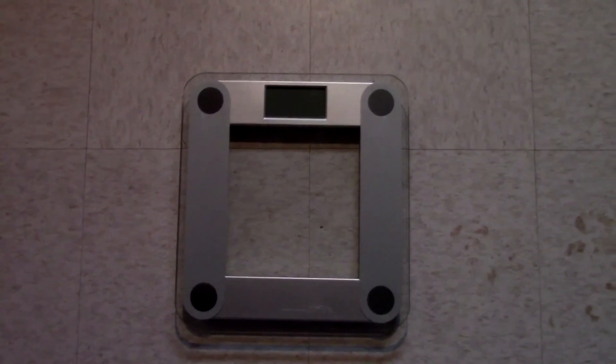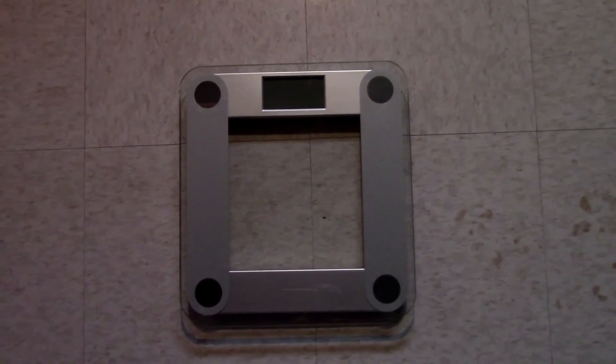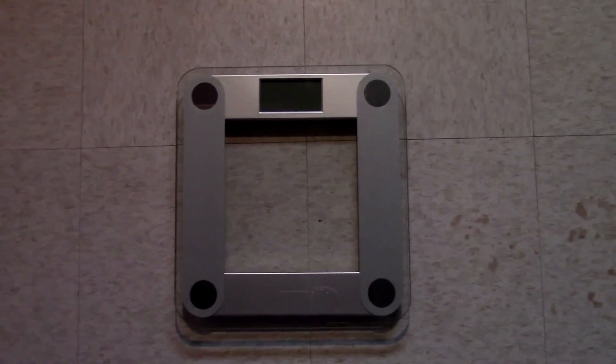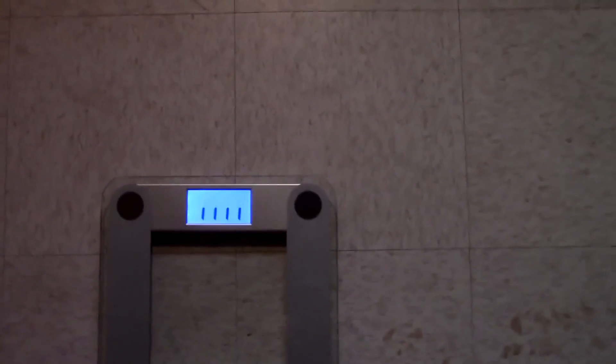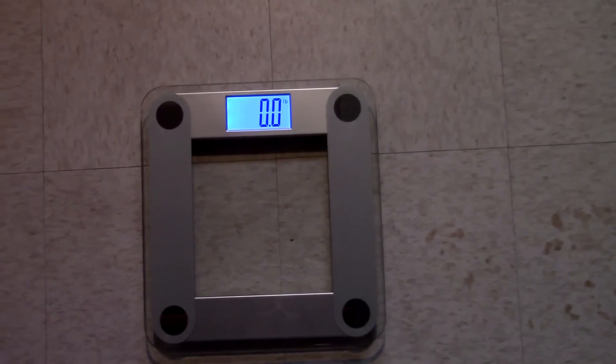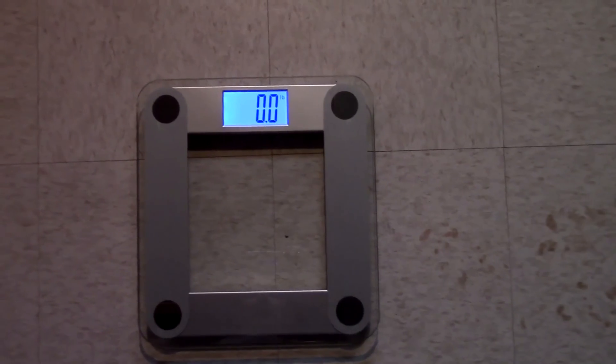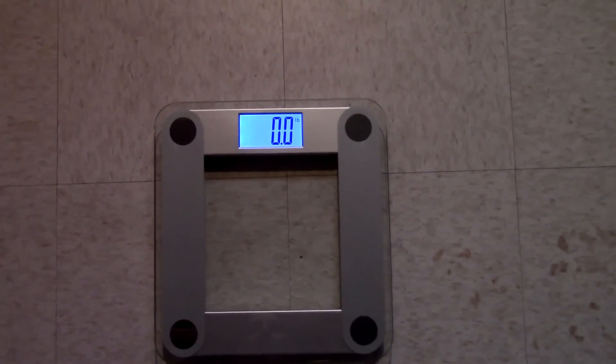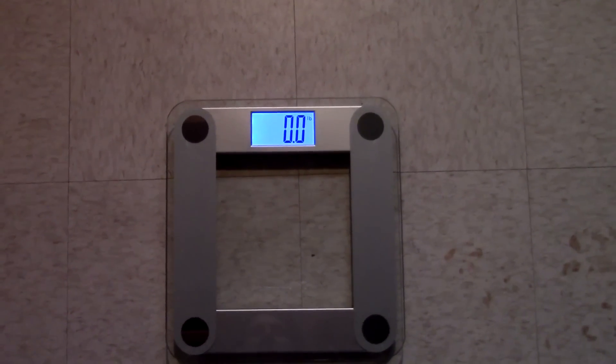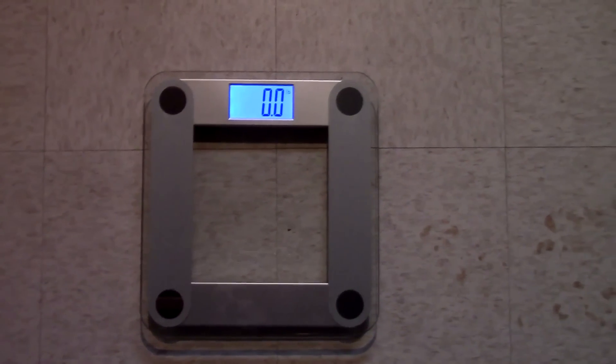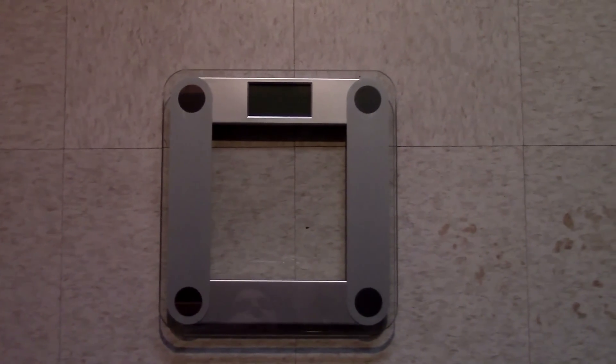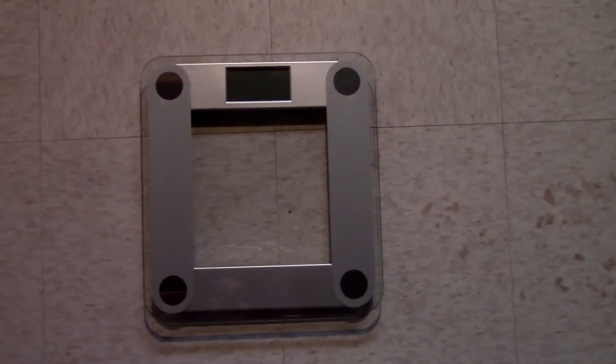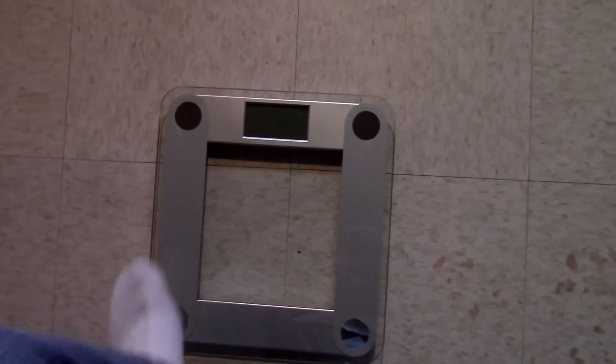So let's go ahead and step on the scale. Anytime you move this thing, it needs to be calibrated to zero itself out. Let's see if it does. And there it goes, it's zeroed. So now anytime from this point that we go ahead and step on the scale, it should automatically read what our weight is. Unless you move it or change the batteries, it should be fine.